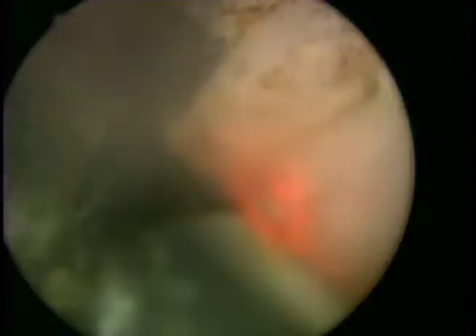One must have good patience, perseverance, and persistence over these stubborn areas to really make sure that each patient gets a complete ablation and tissue removal of the transition zone. This will allow for the best outcomes, the least complications, and more importantly, the durability of such procedures. It is the endpoint definition and the treatment down to that area that is most important, rather than just the laser. The surgeon and the surgical technique really will define how our patients will do.